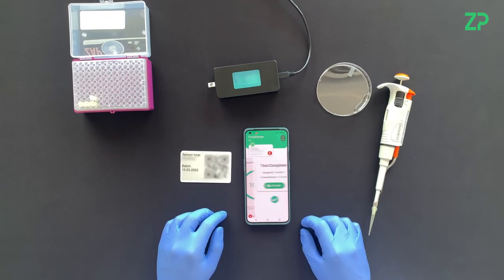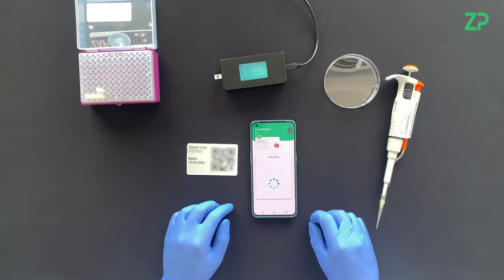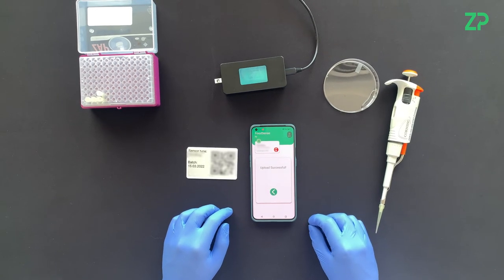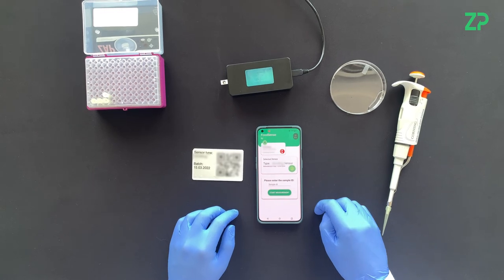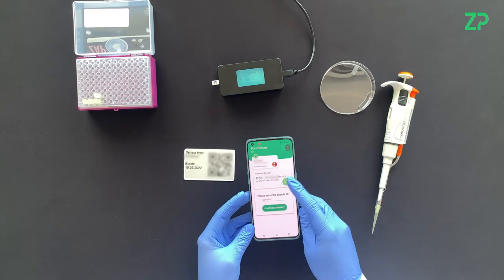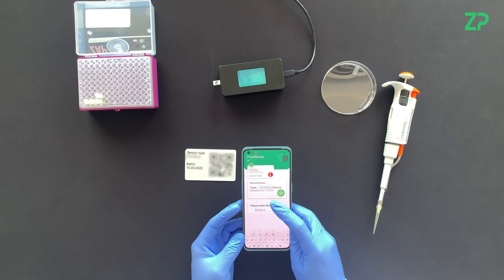Once the analysis is complete, the result is displayed on the screen. The data can then be uploaded to our cloud database, Julie. Another test can begin immediately afterwards using a new sensor, sample, and Test ID.